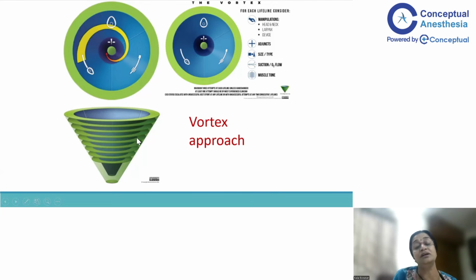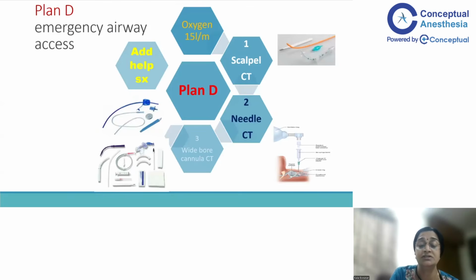So you need not have 3 attempts of laryngoscopy, 3 attempts of SGD. No. The minute you decide that this patient cannot be handled by me, you have a complete right to jump to FONA at any stage and go into the green zone. Use anything, your bag mask, your supraglottic airway, or your endotracheal tube, and finally FONA to jump to the good saturation zone.